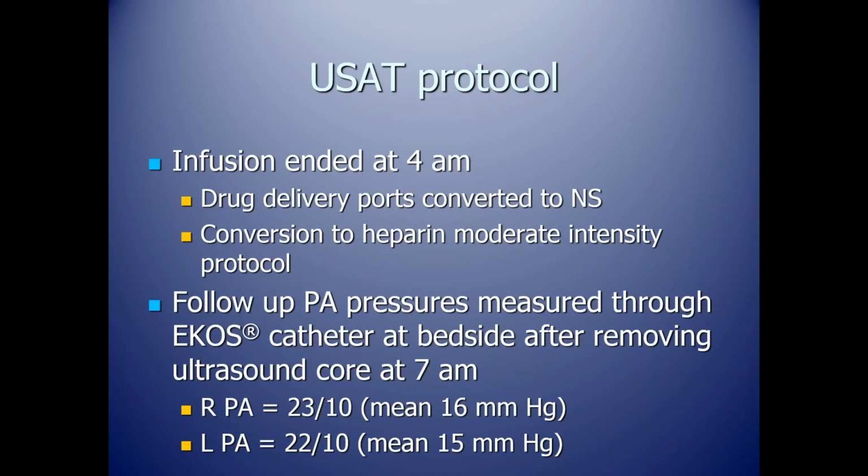In our early experience, we did test this. We feel that this correlates very nicely with pressures you get from Swan-Ganz catheters and pigtail catheters in the pulmonary arteries. So we feel comfortable doing this at the bedside. We do not bring the patients down to the lab for a follow-up angiogram and pressure measurements. We did do that, again, very early on in our experience, but we found that those pressures correlated nicely, and so that's what we do.